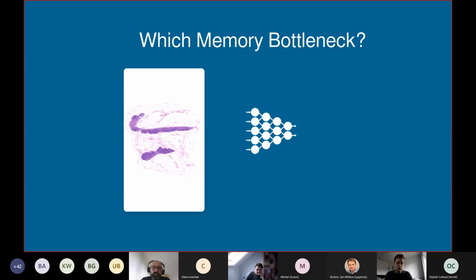So what will happen if you try to do whole slide image classification directly using any kind of neural network is that when you try to even forward it, even at a batch size of 1, you're going to get, well, I think this error is known to pretty much anyone who's ever tried to train a deep learning model. You're going to run out of memory, because the amount of feature maps that you will have to save inside of your memory is just so huge that it's not going to work.